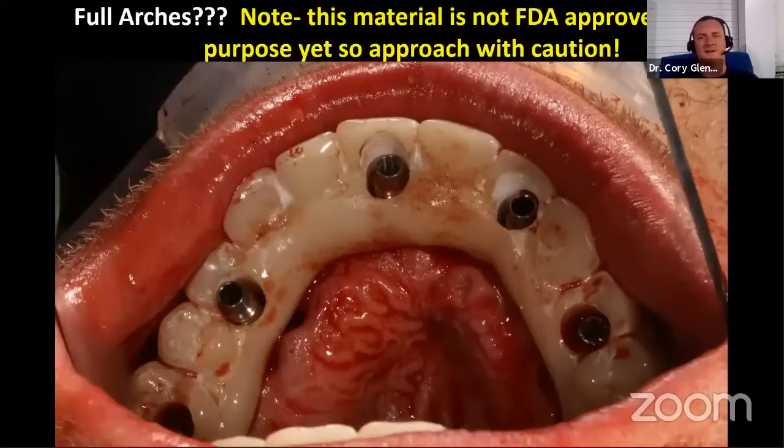Full arches. Again, I started out saying with this new resin, I've done this on probably 15 to 20 full arches at this point. So the workflow we usually do is a bone reduction guide, a drill guide, and then we have the prosthesis where it indexes off the bone and puts it at the right vertical and occlusal position. And we just pre-make the holes so that our cylinders are emerging through that, because we're guiding it. We know where they're going to end up.